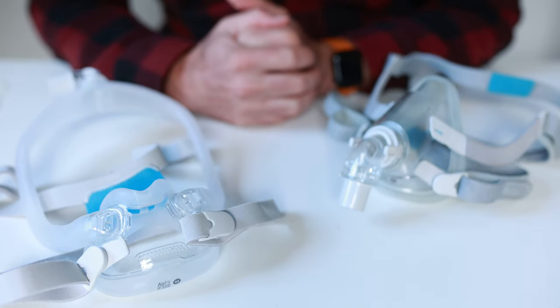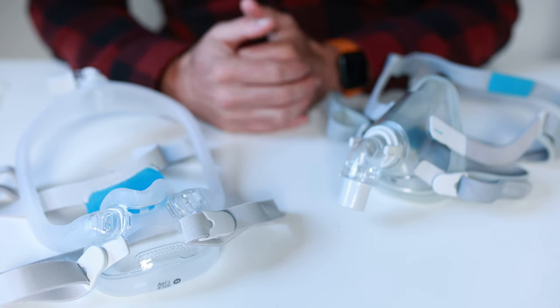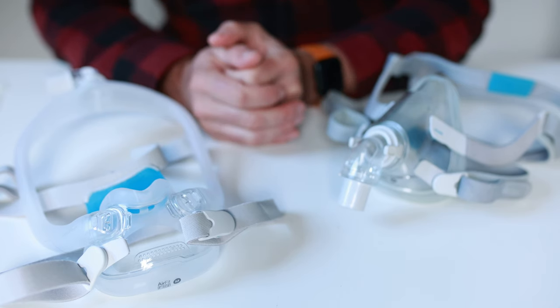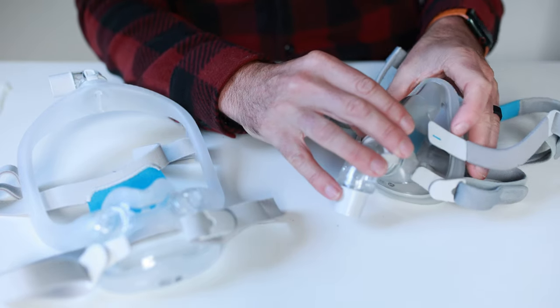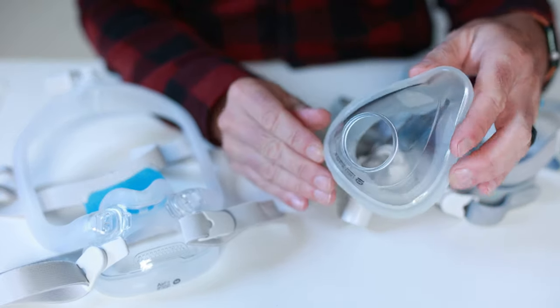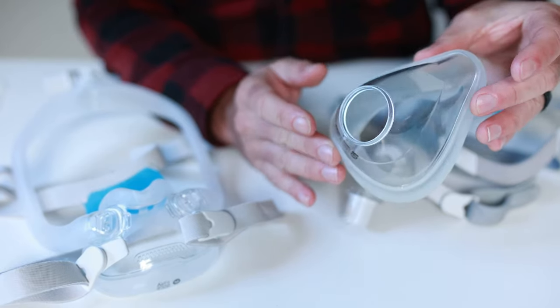G'day mates. At some point in time your CPAP mask is going to break. It's just the way it is — it's unavoidable, it's a matter of time. So it's a great idea to have a few spare components kicking about in your top drawer so when it does happen you're not up shit creek without a CPAP mask.